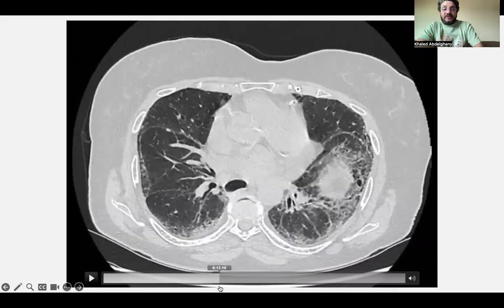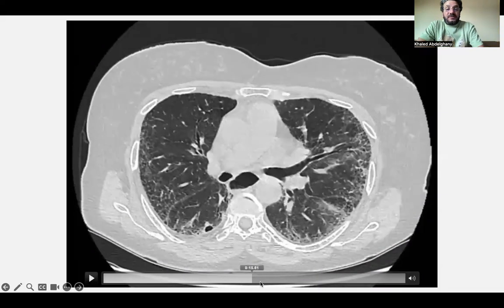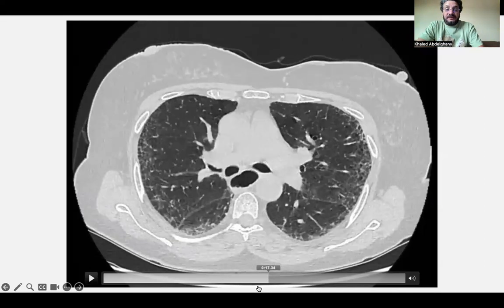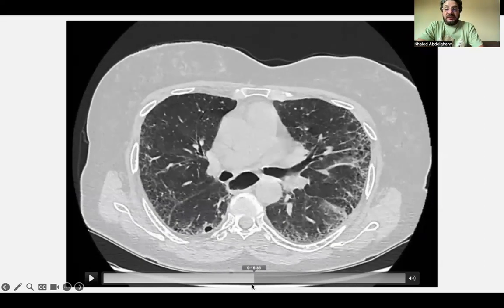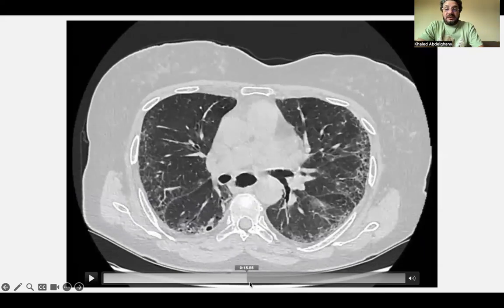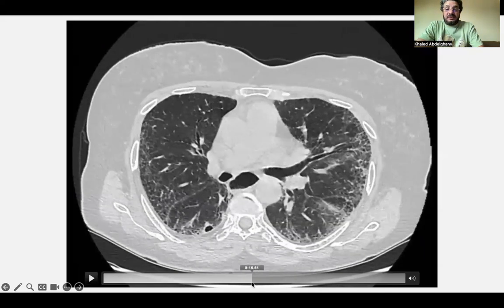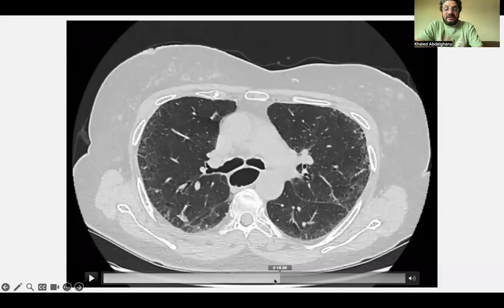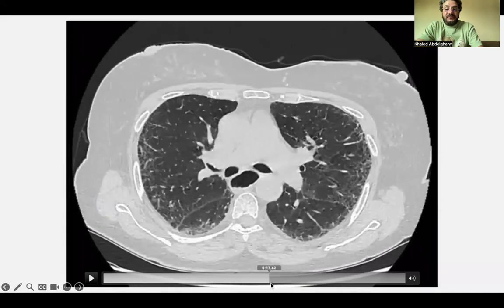Now check for bronchocentricity again. If no bronchocentricity, it will be a case of probable UIP, which is the case here. See the bronchi — they are tapering. Here there is no fibrosis, no irregular reticulation, and no ground glass opacity around the bronchus. They are tapering. So the abnormality and fibrosis is confined to the periphery of the lung.